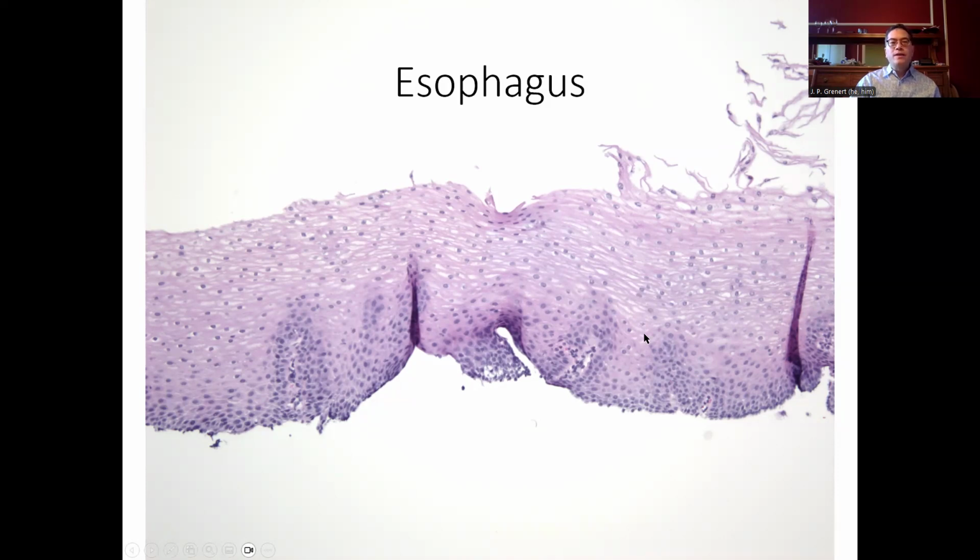And so we see that in generic examples of esophageal injury like reflux disease. One other thing to note here is that there are these little vascular papillae, and normally these don't go any higher than about halfway up or so in the mucosa. When you start to see them approach the surface of the mucosa, then you start to again think about the possibility of some sort of reactive process and esophageal injury.